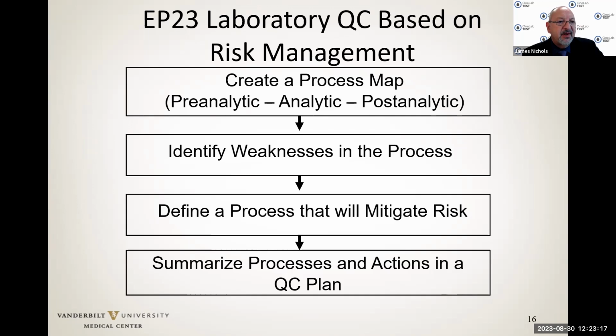So we have to understand pre-analytic processes outside the control of the laboratory sometimes, analytic processes, as well as post-analytic. As we step through stepwise the procedure, we want to identify weaknesses in that process. At each step, ask the question, what could go wrong here? And have we considered this?